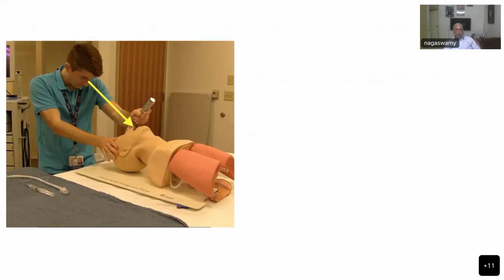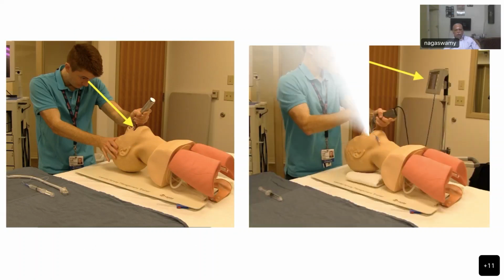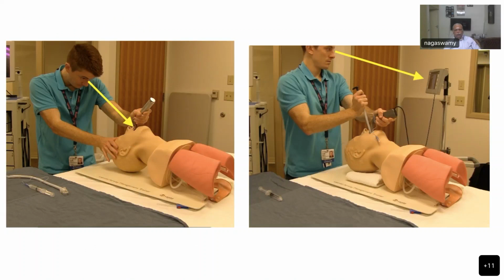Now, this is your conventional Macintosh laryngoscope. In the mannequin, what you see, all of you are used to this. You place the laryngoscope in the oral cavity and the person is bending to look into the throat. On the contrary, a person who is doing video laryngoscopy has already passed the scope and is trying to visualize it on the monitor. So no direct line of eye contact is required.